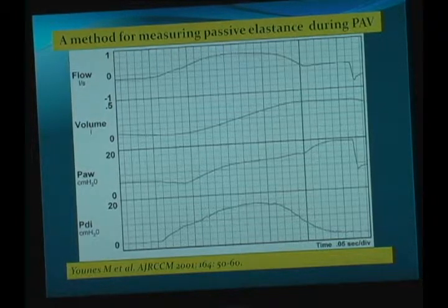The differential point that starts the clinical use of proportional assist ventilation is the ability of machines to continuously monitor mechanics on the patient, which the inventor of proportional assist ventilation explained years ago.